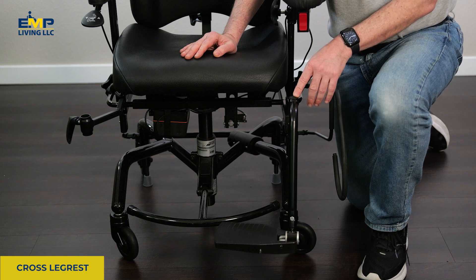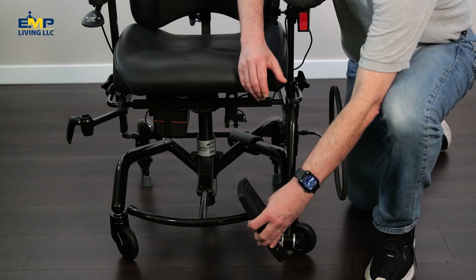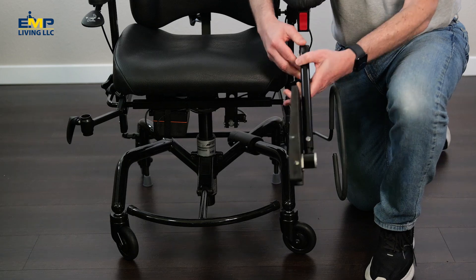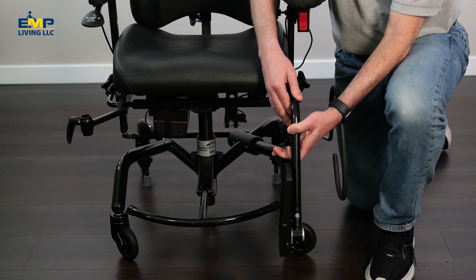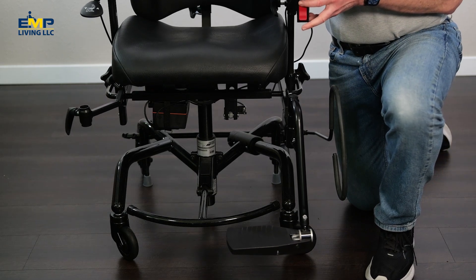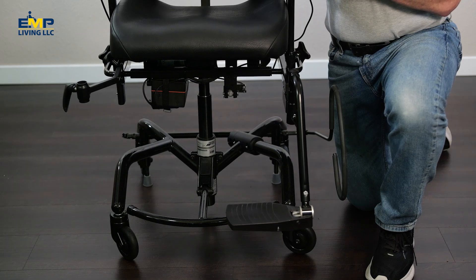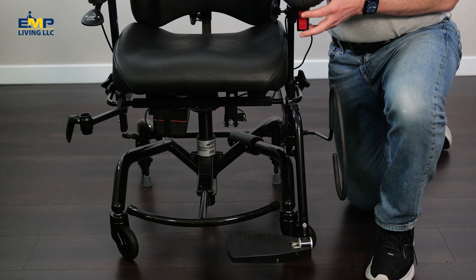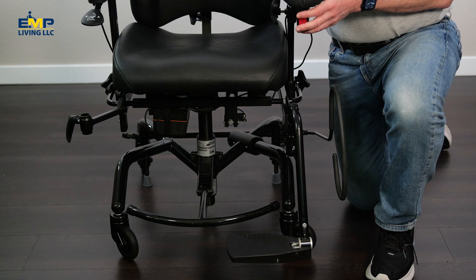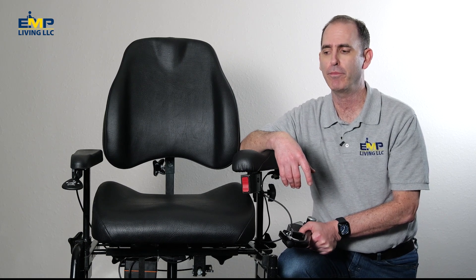This is what we call our cross leg rest — it's a wheelchair-type leg rest. The foot plate lifts up out of the way, you can swing it to the side, and it's removable. This footrest is attached just below the seat cushion, so when you raise and lower the chair the footrest moves up with the chair. If you're sitting up high, this footrest will provide support. This leg rest is typically chosen by adults, as it allows them to remove it when they don't need it.